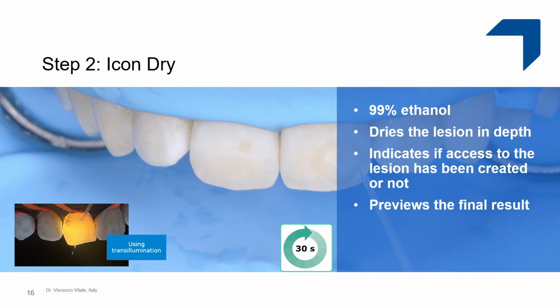It's important to avoid over-etching, which may damage the enamel structure. If results remain unsatisfactory after 3 cycles, further evaluation is recommended. As with any dental procedure, taking photographs is helpful at each step. Once the spots have visibly diminished, we can move to an infiltration step.